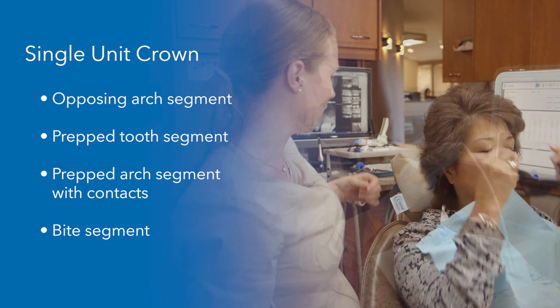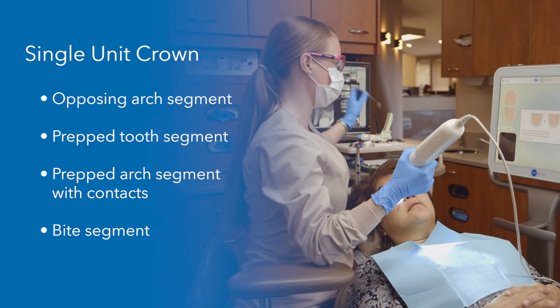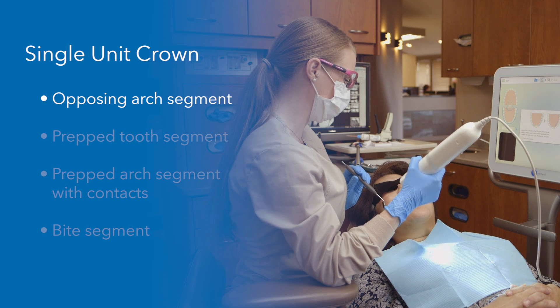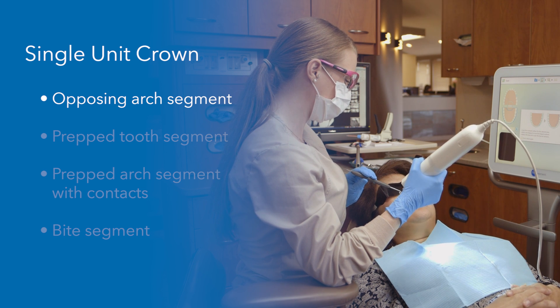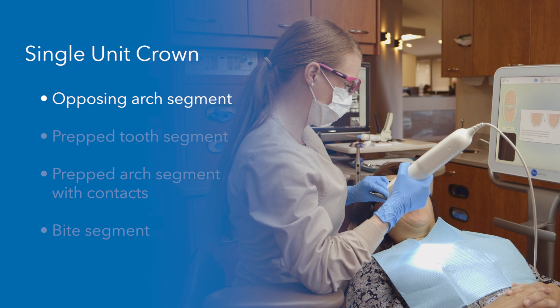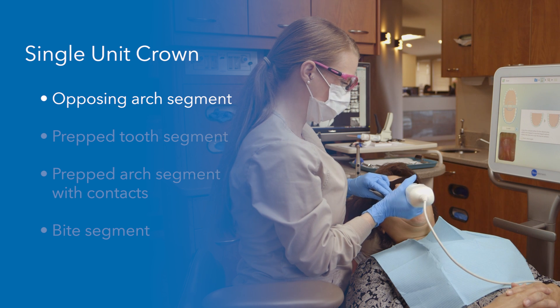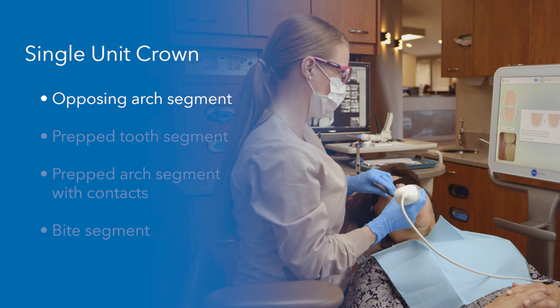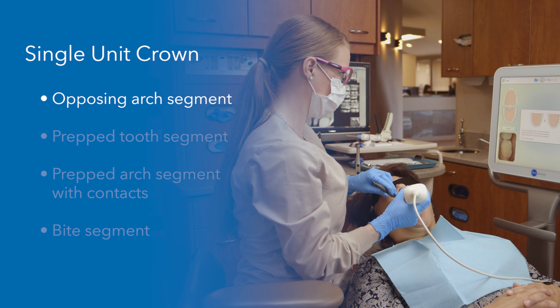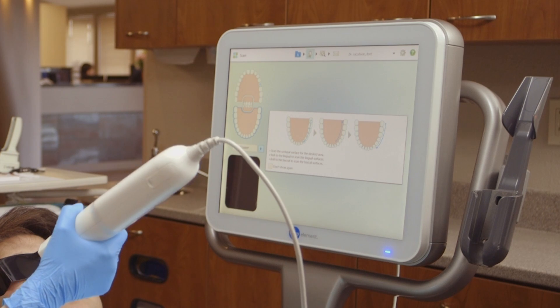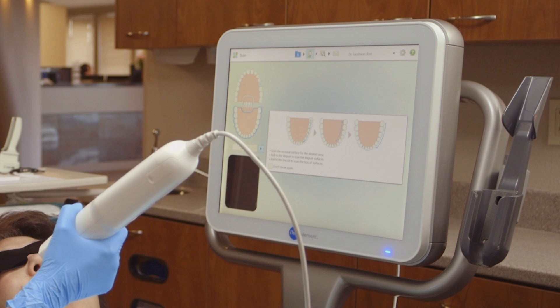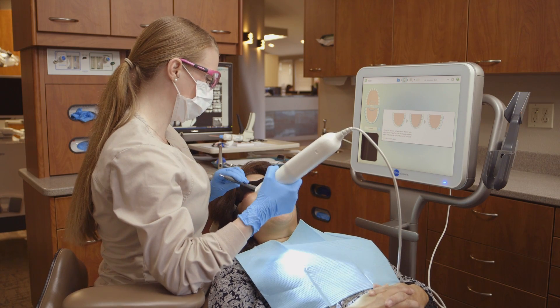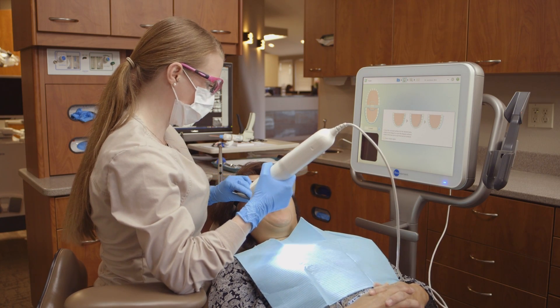It's important that I only scan the anatomy I want included in the model. The first segment is the opposing arch. In my practice, I typically have the assistant scan the opposing arch while the anesthesia is taking effect. The iTero Element scanner allows me to scan in a continuous motion. Using the guidance hints to remind me of the recommended scanning protocol, I'll begin by scanning the occlusal of the opposing arch segment.